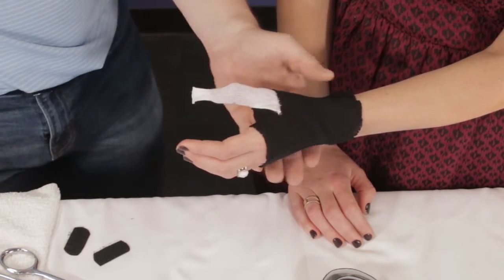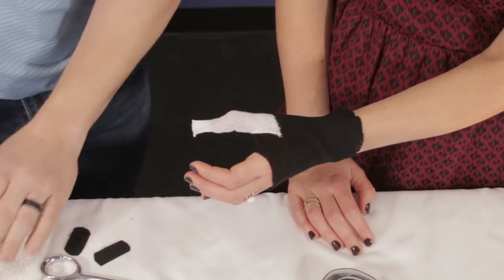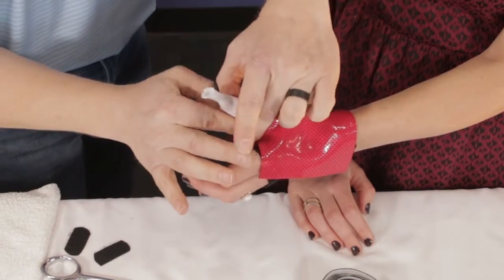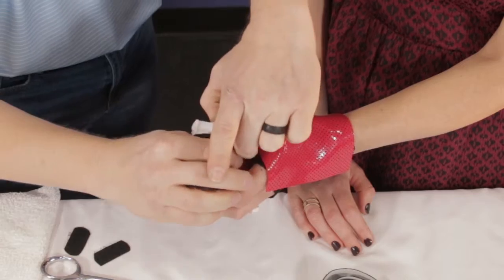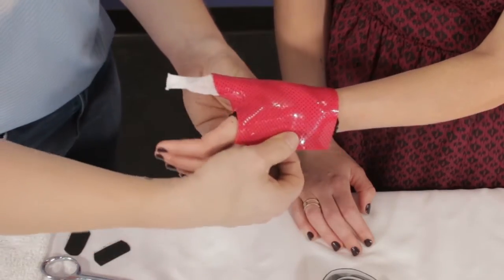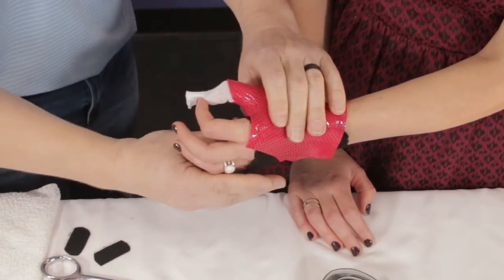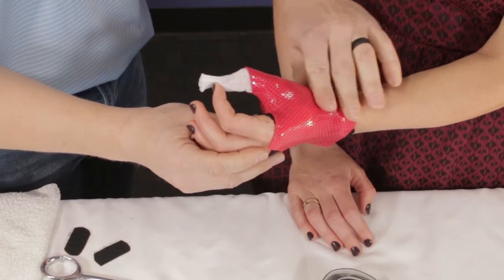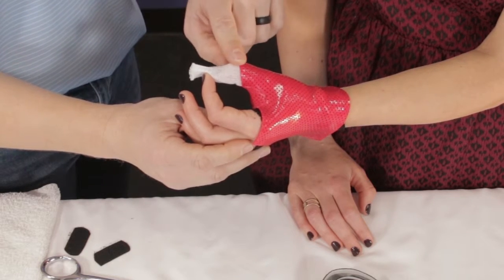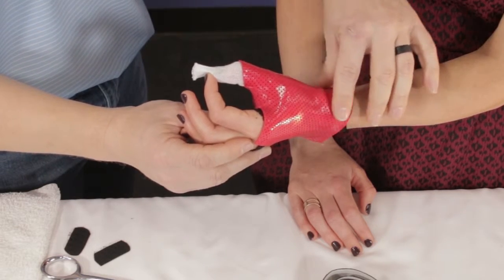Now I'm going to pull the material out of the water and dry it off just a little bit. The notch goes on the back. I'll pull through and hold that one down, then pull through on that angle that I cut, and take a second to get a nice solid bond between those two. I'll pull them down around the back just at the ends. We're going to do that gentle tip-to-tip touch. While she's holding there, I'll make sure we have nice smooth lines, no sharp edges, everything's where it's supposed to be.